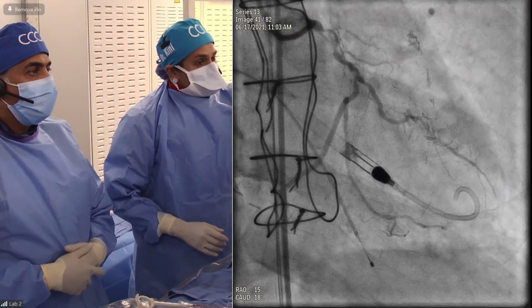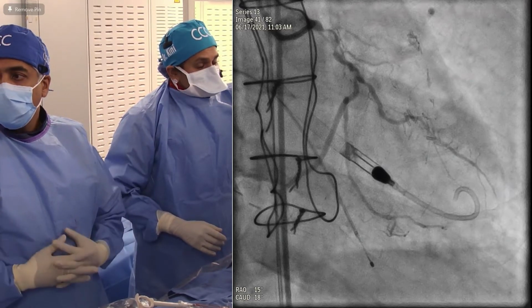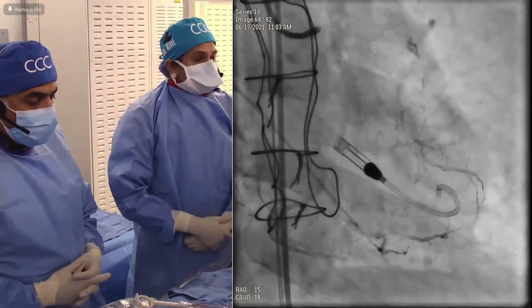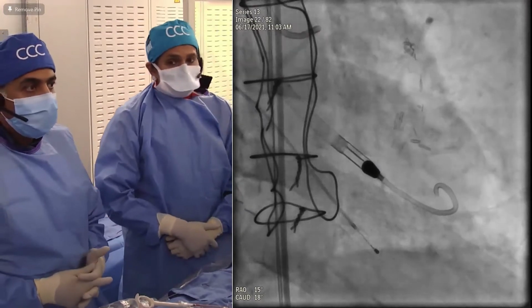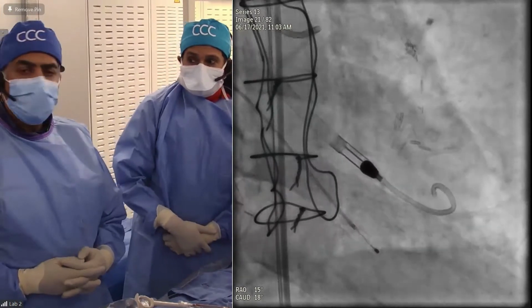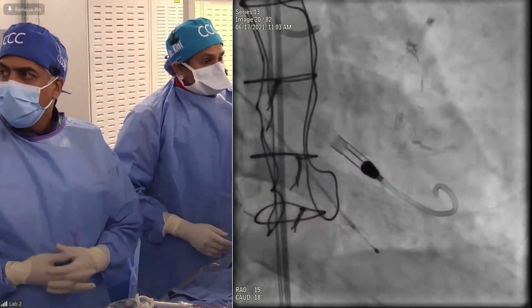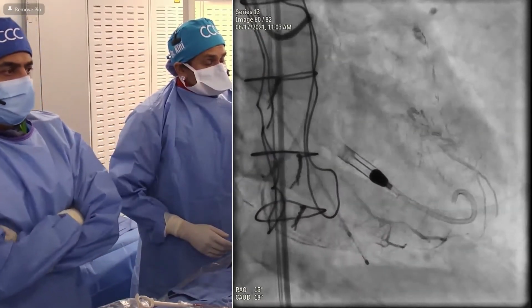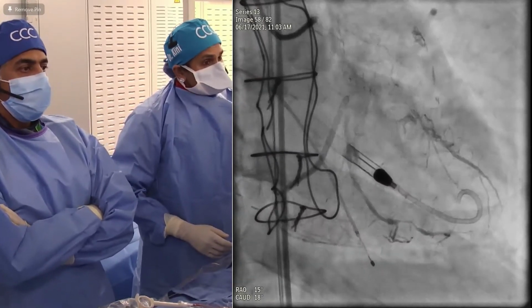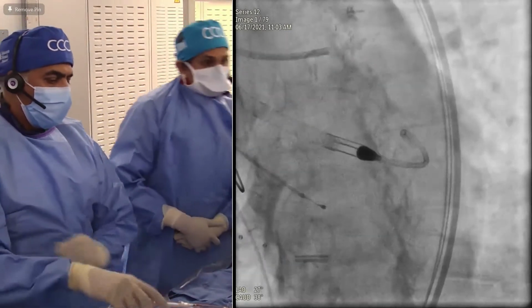We have your app up there. It's showing us what we should be doing here. But Dr. O'Neill? I think the most difficult part of this is getting the rotor wire down distally. I think that's going to be the biggest challenge. You can wire something, but actually getting the exchange is going to be quite difficult. Dr. O'Neill is saying that the most difficult and challenging part of this is getting your rotowire distal into exactly where you want to ablate. That's going to be difficult, even in the exchange, etc. So that's going to be really, really interesting to watch. So tell us, what's your plan, Dr. Kinney?